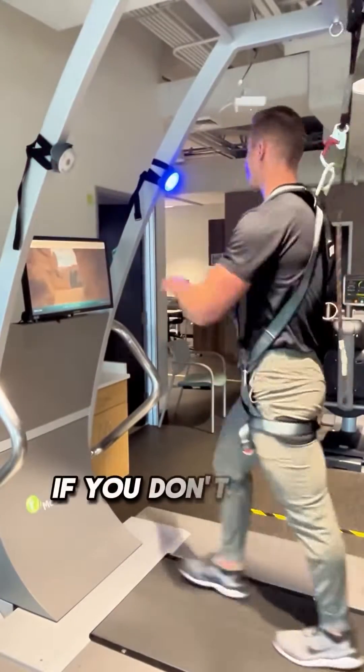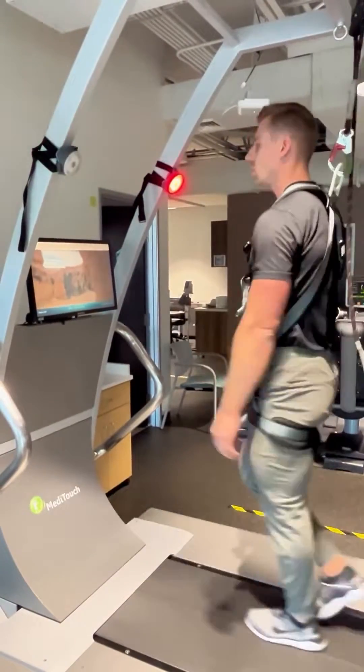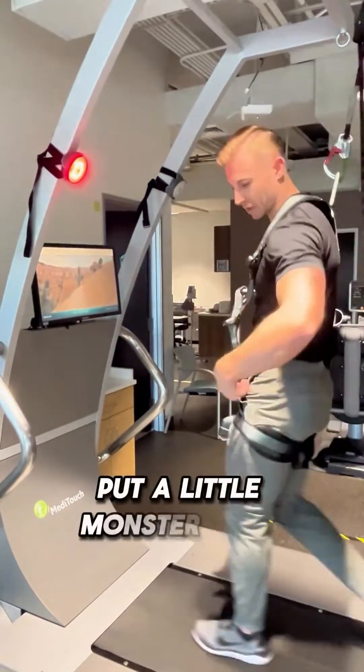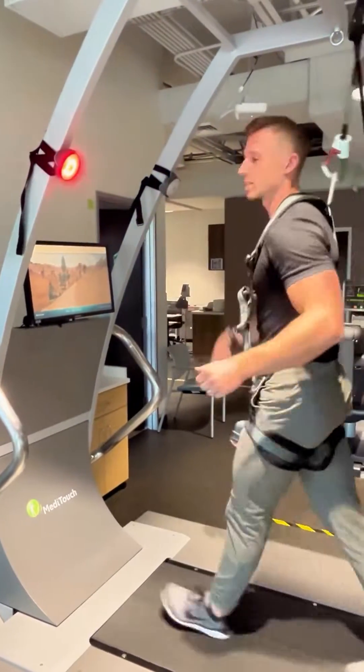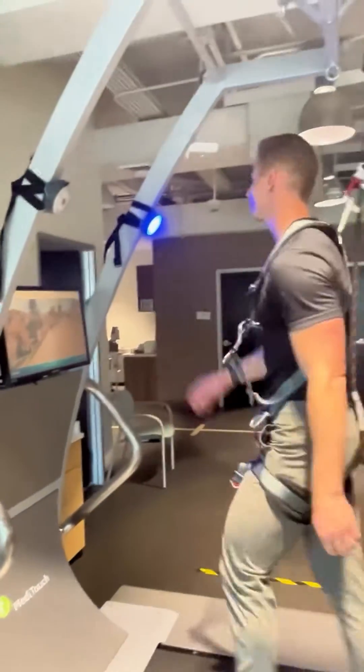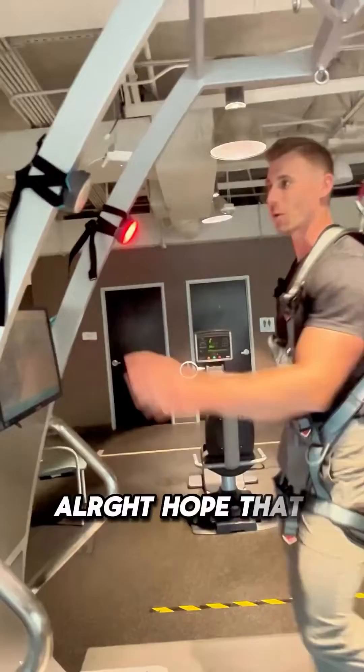If you don't have this fancy equipment, you can always just have them walk over ground, put a monster band around their waist, and give them a couple of tugs side to side, and use some targets. Hope that helps — have fun!